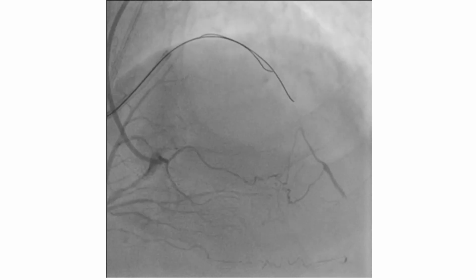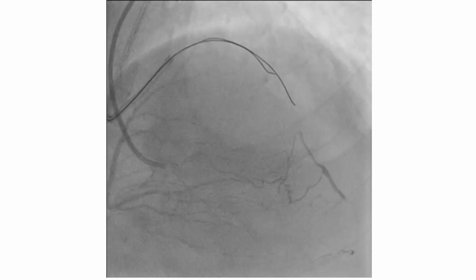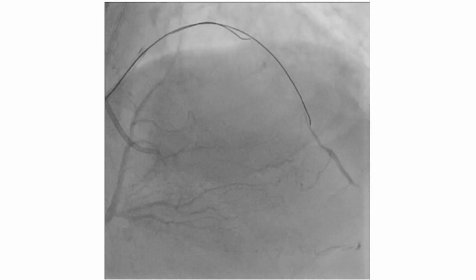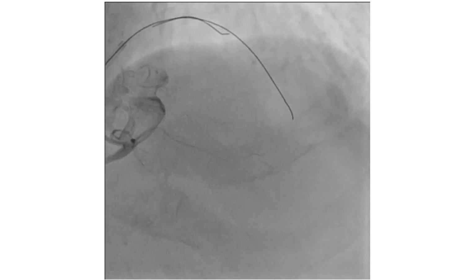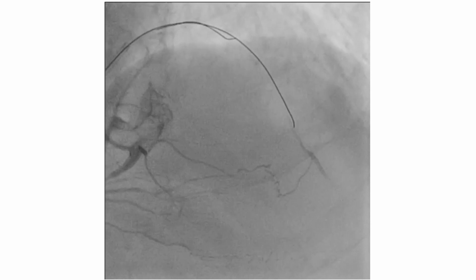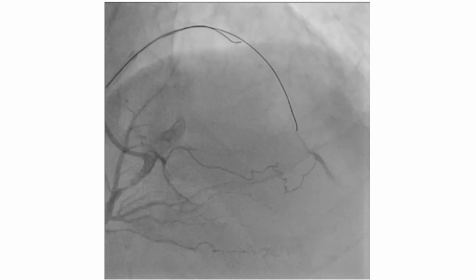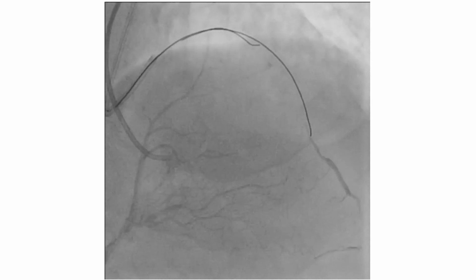The first wire was not useful in crossing the lesion, so it was left in place, and the Miracle 6 wire was taken. It passed to the mid part. With further manipulation, we managed to pass to the distal cap, and here comes the importance of contralateral injection. It shows the wire to be in the extraluminal space. At this stage, one can use fancy equipment like a dual lumen microcatheter or equipment for dissection and re-entry, which I believe most cath labs lack.